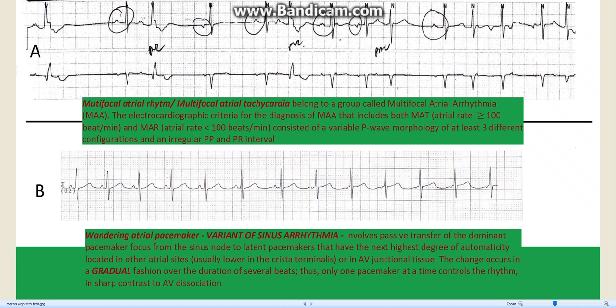Strip B on the other hand is also irregular, but there is a gradual change in the shape of the P wave as you go from the left to the right. This is what you see in wandering atrial pacemaker.